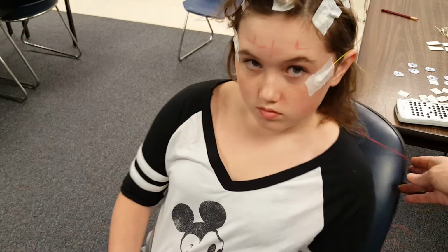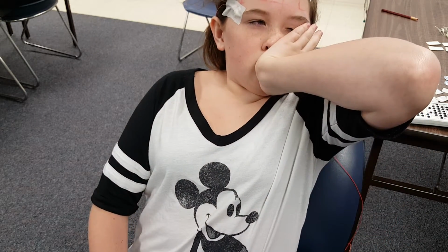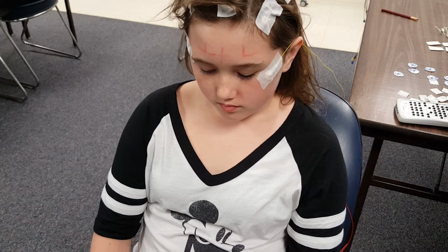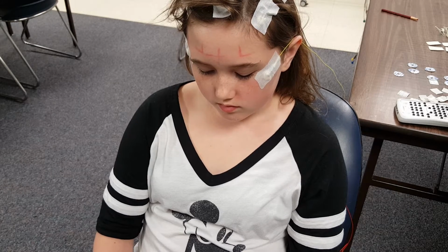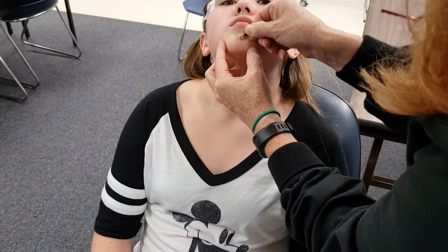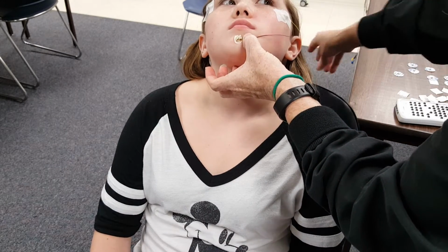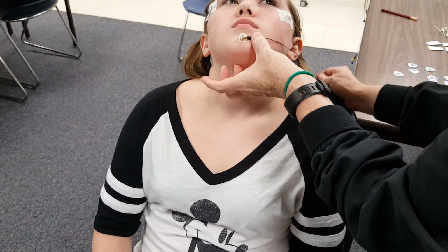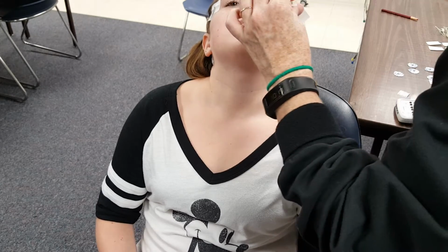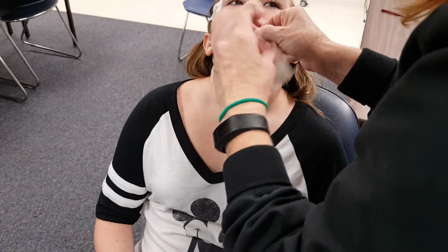Okay, can you turn a little bit here, Kira? Let's do the chin. Again, the chin is about 1 centimeter up from that bone, right in the center of the chin. Put your head back. There you go. And again, I take the wire and tuck it behind the ear. Well, I try. Oh, it's coming off. Whoa. I maybe didn't prep very good there, huh?